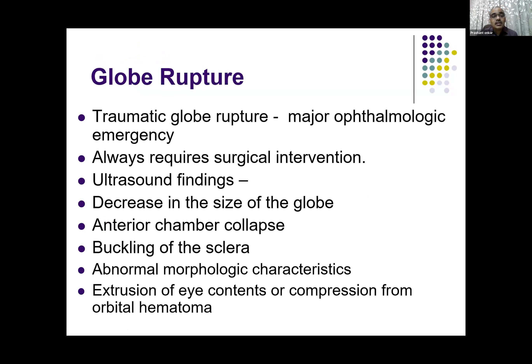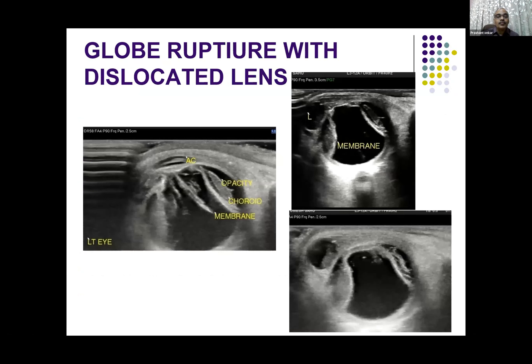Another emergency is a globe rupture. The traumatic globe rupture is an ophthalmologic emergency and almost always requires surgical intervention. Ultrasound findings include decrease in the size of the eyeball as vitreous exits, the anterior chamber is collapsed, and the membranes buckle. There can be abnormal morphological characteristics depending on how the injury occurred, and sometimes you can see extrusion of eye contents or compression from orbital hematoma.